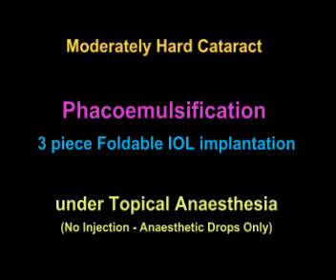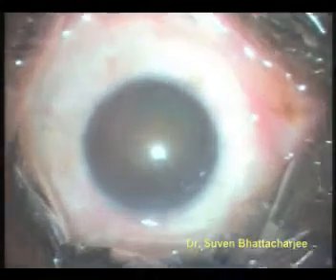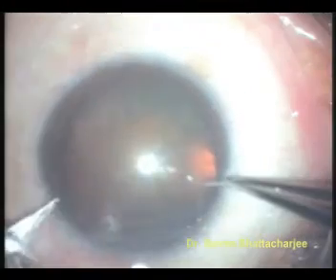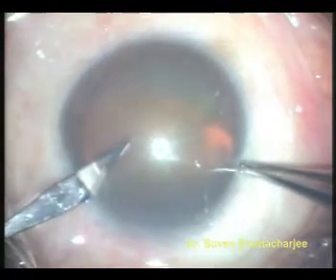In phacoemulsification, the cataract is broken down and sucked out by a needle vibrating at an ultrasonic frequency. Facilities may vary from surgeon to surgeon. In this case, the cataract surgery is being performed under topical anesthesia, which means there are no injections and there is no pad after the surgery, and the patient can resume all normal activities right from the day of surgery.